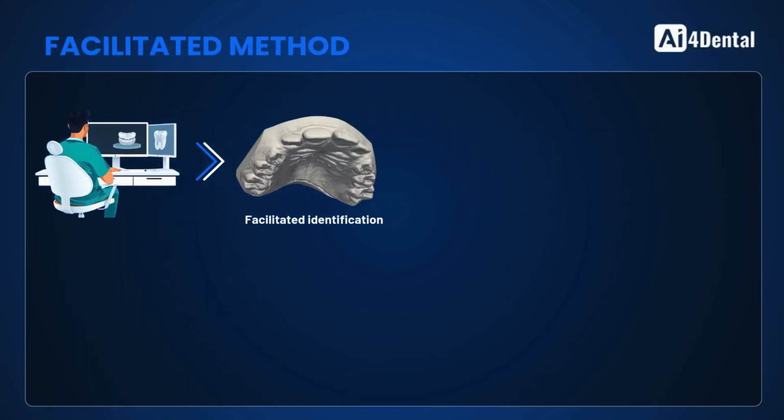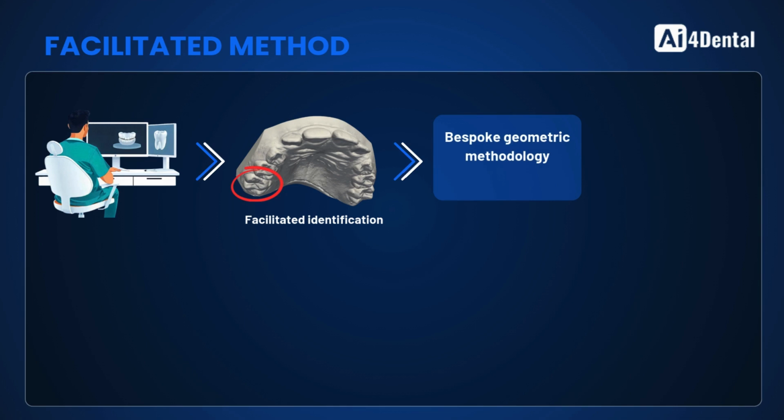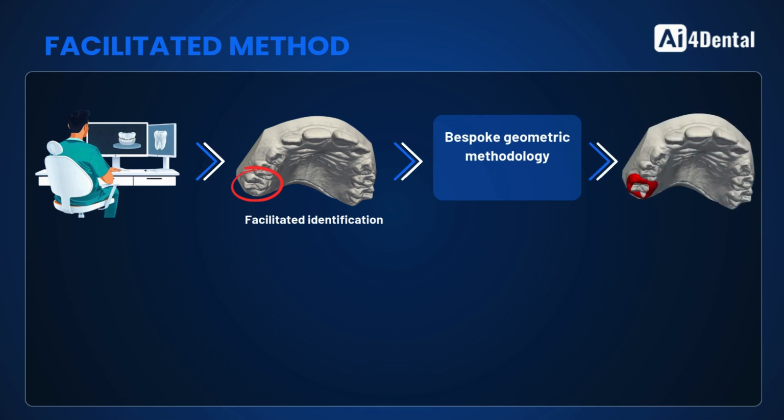For the initial modeling step, specialized dental CAD software uses what is known as an assisted approach. This means that when working with a scan in CAD, users must click on zones that the software will then identify, for example, a tooth. Alternatively, users may draw a boundary with a cursor, after which the software automatically extracts the desired area. But this is assistance, not complete automation.